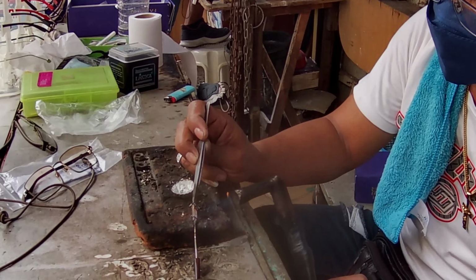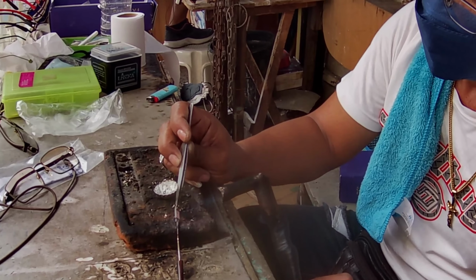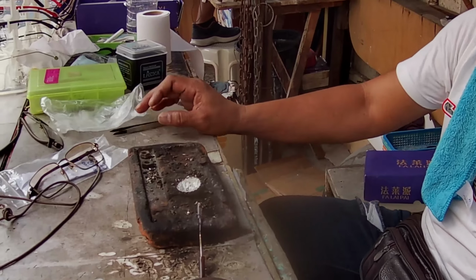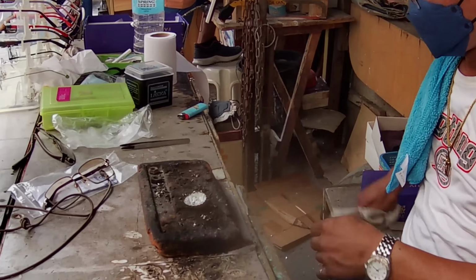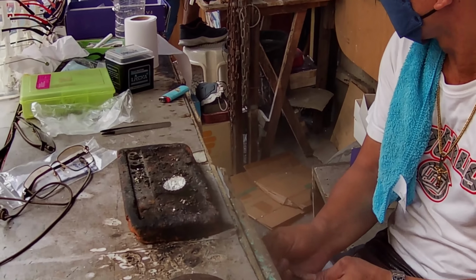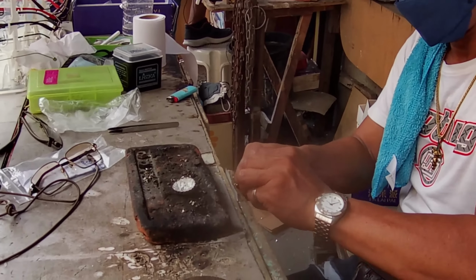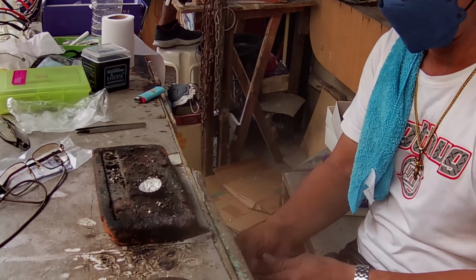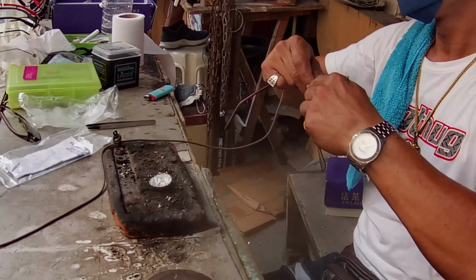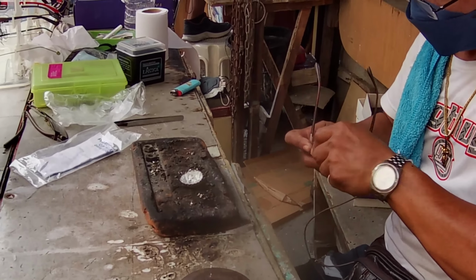You can go to any jewelry shop in your place, because they're the ones who do joining or connecting, especially jewelry, necklaces, rings, and yes, especially eyeglasses. They can also do gold plating and silver plating. So as you can see, it's very fast now. So it's done. I need to put in the proper screw.